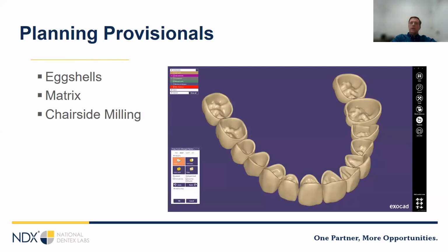The provisional is going to be the patient's best opportunity to see the planned results in his or her mouth, and it's critical that we get a good result. As you guys know, anybody who's done a case like this, prepping and pressing a full arch like this is time consuming, and you feel a little beat up by the time you're done, from what I hear. I'm a dental technician, I've never done it, but I have talked to a lot of people about it. So we want to make the provisionalization as predictable as possible so that we get a good result for the patient. We're not killing ourselves at the end.